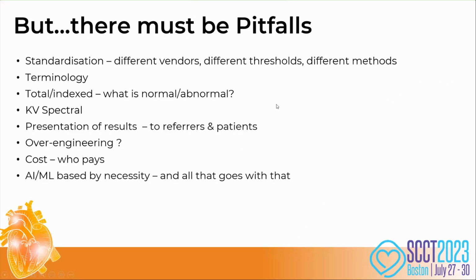There must be pitfalls of plaque quantification software, and there is. Currently, there's no standardization. We have different vendors, different thresholds, different methods. The terminology has not been agreed by societal groups. We don't know whether we should be using total plaque or indexed plaque. We don't know how this performs across different kV spectra. How should the results be presented?